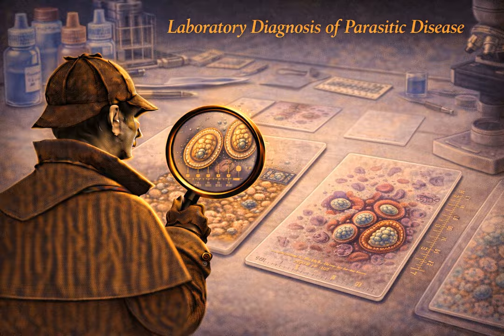Right. Because parasitology relies heavily on morphology, recognizing tiny, subtle shapes and patterns. If a lab tech only sees a malaria blood smear, maybe once a year, they are incredibly likely to mistake a clumped platelet for a parasite or some stain artifact for a deadly amoeba. It requires constant, repetitive practice. It's a volume game. If you don't see it regularly, you lose the eye for it.